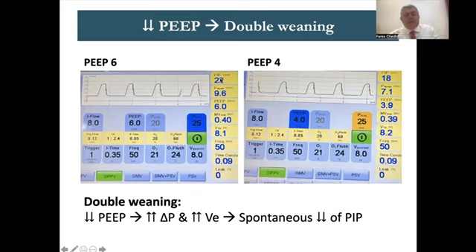What I suggest you do if the patient has improved, as in here, is decrease the PEEP only because I cannot have any effect on the PIP. I decrease the PEEP only from 6 to 4. Then, because the PEEP was decreased from 6 to 4, the gradient has increased from 16 to 18, because this was 22 and this became 4. The gradient has increased. That would produce a bigger volume, and because it produced that higher volume, the volume will be higher than the VG and the PIP will be pushed down.